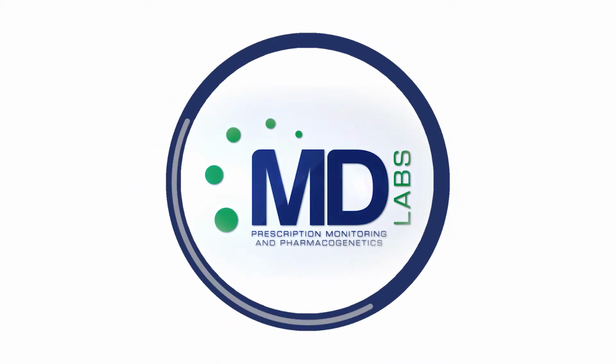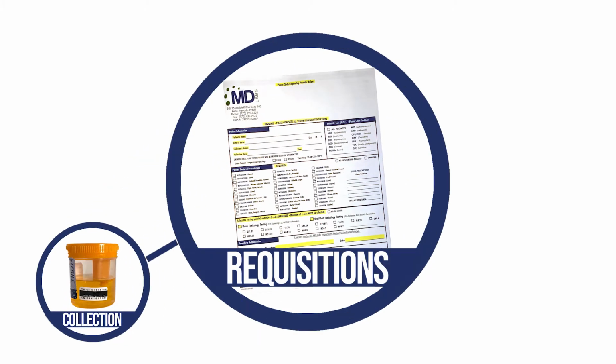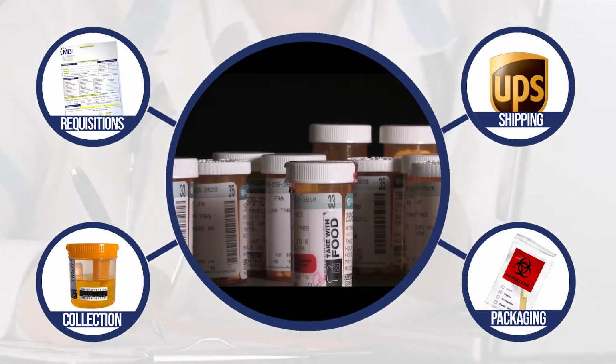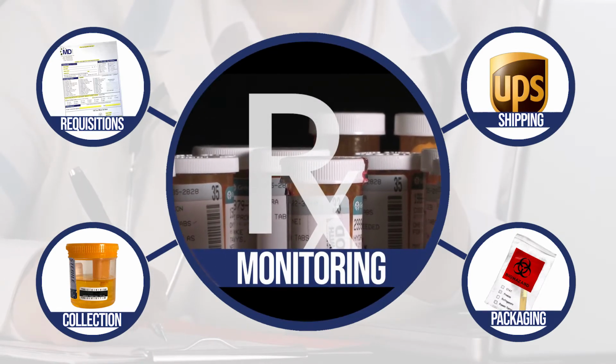Welcome to MD Labs Toxicology Specimen Collection video. This video illustrates proper procedures for collection, requisitions, packaging, and transporting urine and swab specimens to MD Labs for analysis as part of a patient prescription monitoring program.